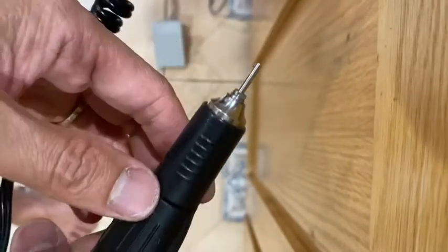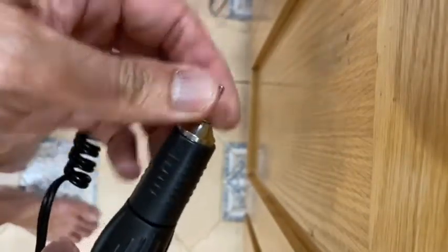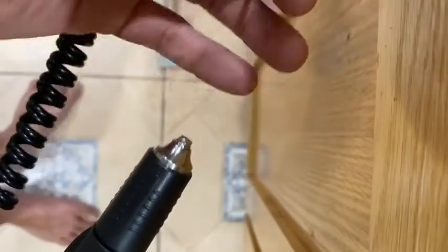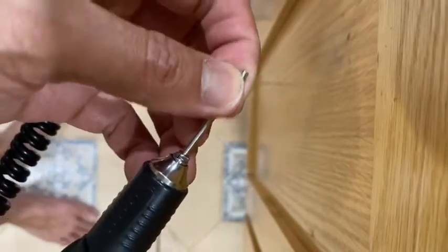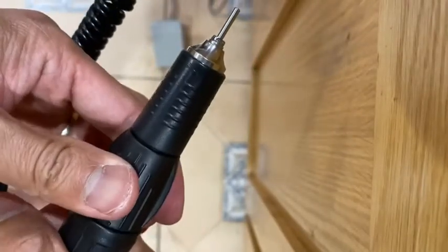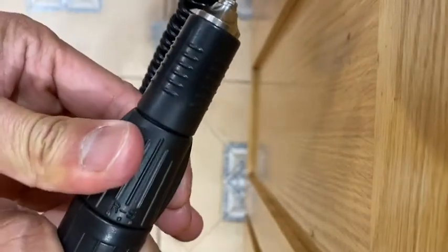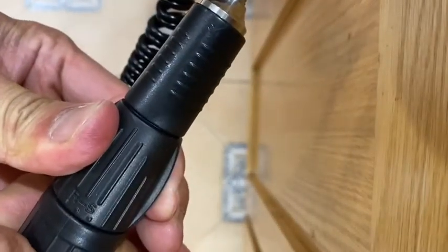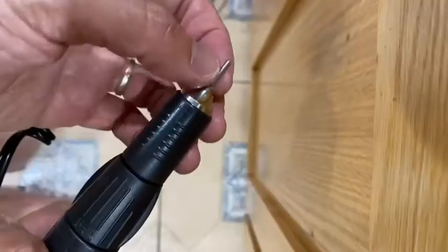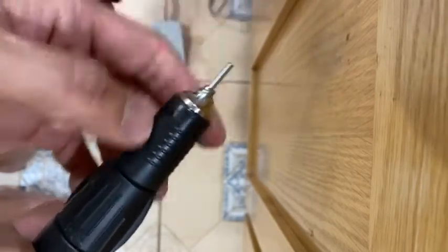To lock it, you turn this way and it's locked. To unlock and take it out, you turn the other way. Put it in, it's loose, then turn to lock. To remove it, unlock by turning forward, and then take it out. I'm hoping none of you have to struggle with this after watching this video.